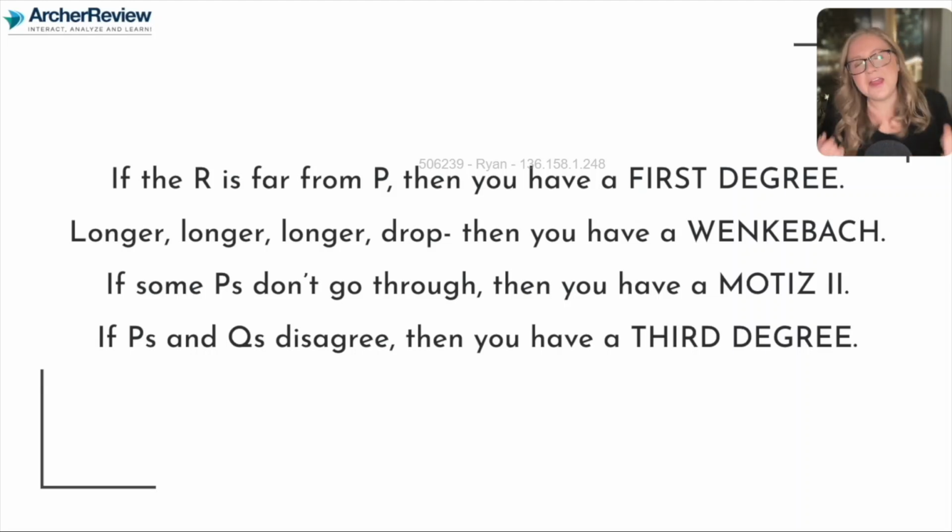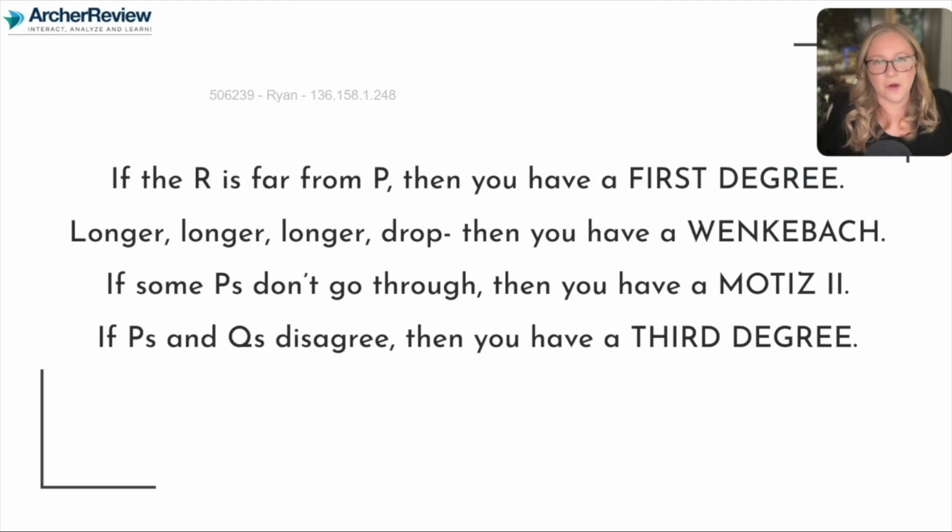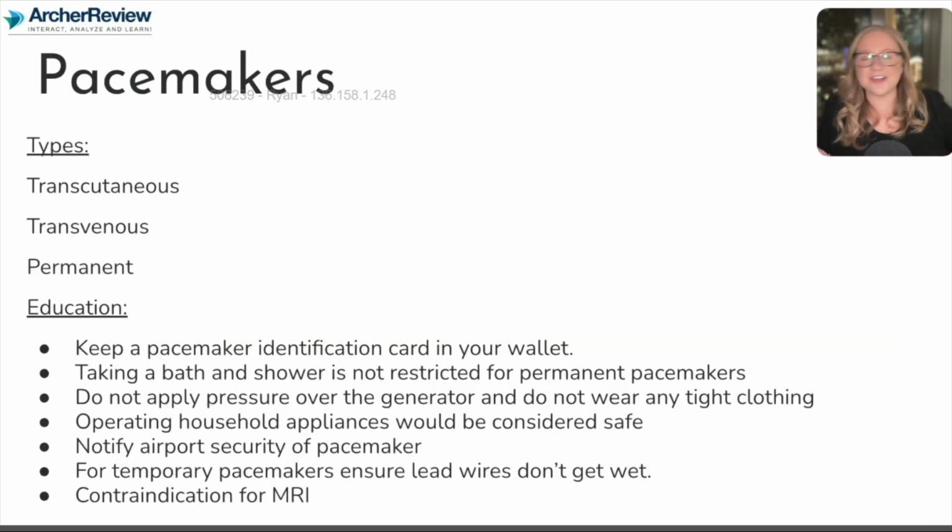So I know this might be a little bit silly, but I promise for me, it really helped to cement what the findings on the EKG were for all of these different heart blocks. And as I mentioned with these different heart blocks, the main intervention was pacing. So this seems like a good idea to tell you guys a little bit more about actual pacemakers.